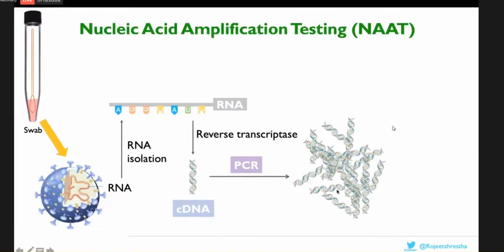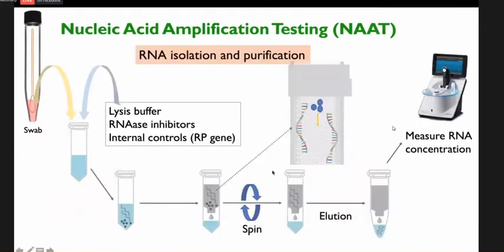So the detection of the unique sequence of RNA fragment of the coronavirus is diagnostic, and this test can be used to diagnose COVID-19 in its early stage when the patients are highly infectious. To perform this test, first viral RNA should be extracted. Several RNA extraction or purification kits are commercially available for convenient, fast, and effective isolation.